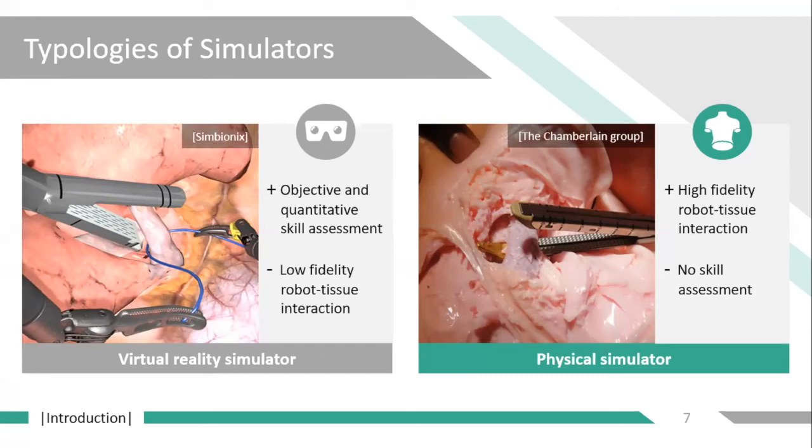On the left, we have virtual reality simulation, which, among all the advantages that it brings to the table, offers a quantitative and objective skill assessment of the surgeon's ability. Unfortunately, virtual reality is still afflicted by a low fidelity of robot-tissue interactions.